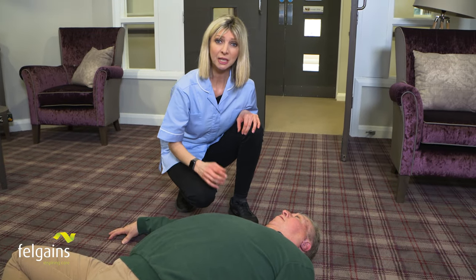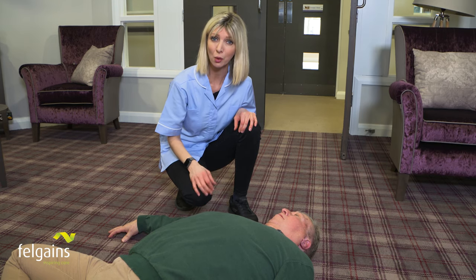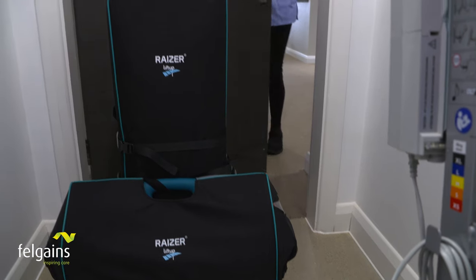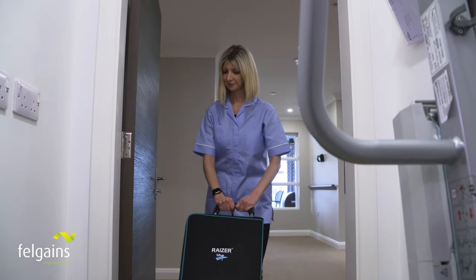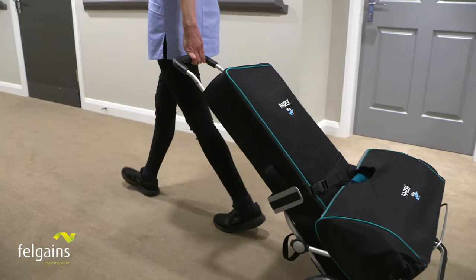Lifting a fallen person is traditionally a task for two people — a task with a very real risk of back injury or other serious musculoskeletal damage. The answer to these issues is the Raizer 2 Emergency Lifting Chair: the new and improved, truly single-handed solution for lifting a fallen person off the floor.